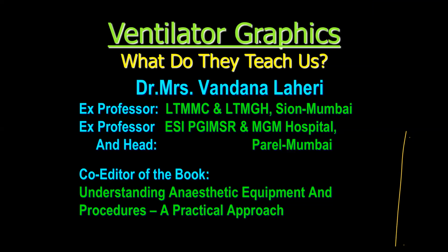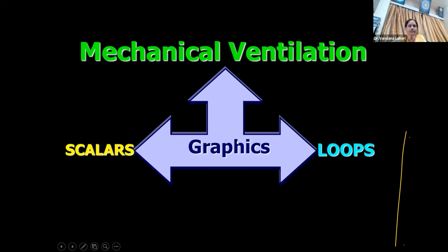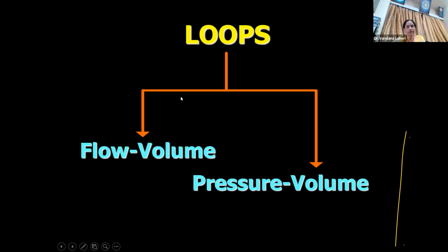Now, what we're going to do today is learn ventilator graphics. What do they teach us? Generally we see graphics when a patient is on a mechanical ventilator, because we see graphics on the screen. This graphic is divided into scalars and loops. Scalars are generally called waveforms. They may be flow time, pressure time, or volume time. Loops are flow volume loops or pressure volume loops.